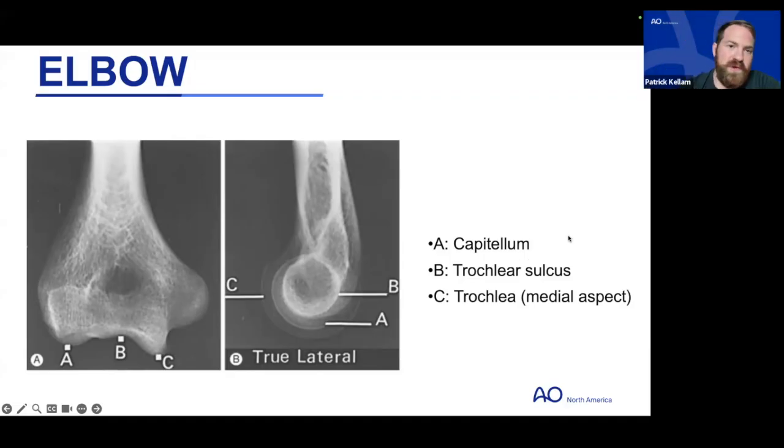Yeah, so I think when medical students and junior residents are in the ER and they're getting fluoro shots on a mini C-arm, the two joints that can be really difficult for them to obtain laterals of are the ankle and the elbow. And the elbow, because it's complicated, you think you have a lateral because you have one circle, but there's actually three concentric circles in the elbow. And this slide really nicely shows that, there are three circles that are superimposed, but they're at different sizes.